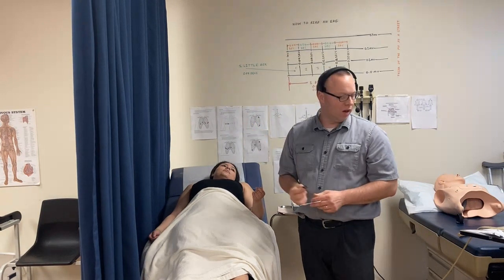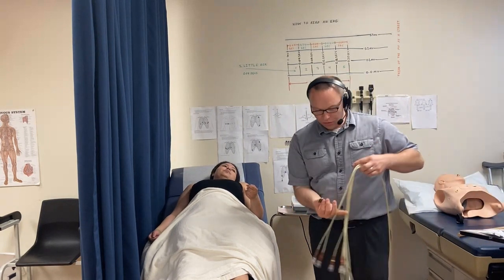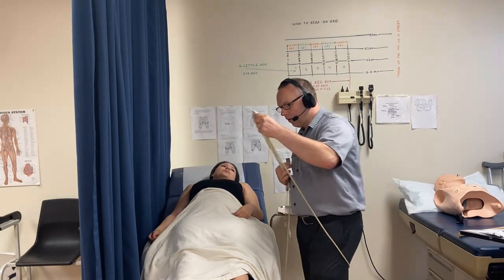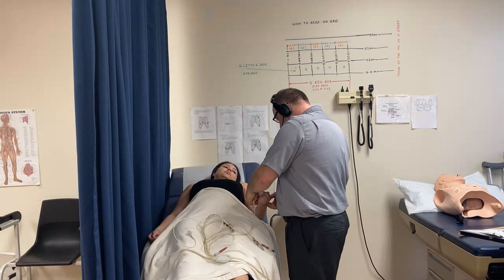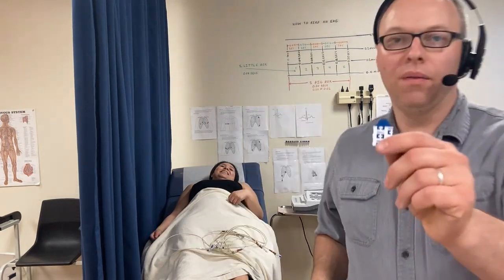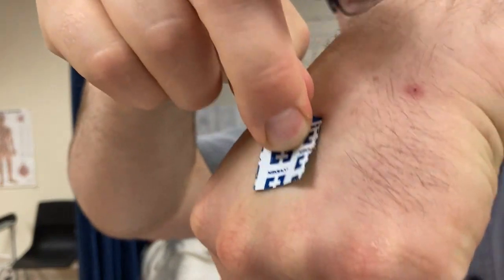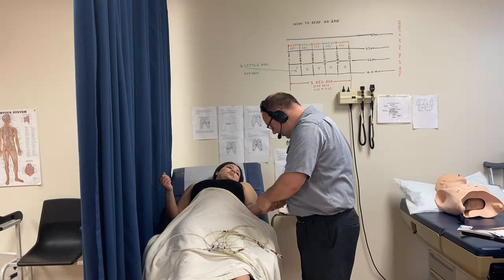A lot of students ask how to hook up the electrodes. The key thing is tab orientation — the wires will tell you. If the wires are coming from below, face the tab downward so the wires pull the electrode onto the skin. You don't want the tab facing up with wires pulling back, because that will pull the electrode off the skin. You want the wires pulling the electrode down onto the skin, keeping it nice and stuck.